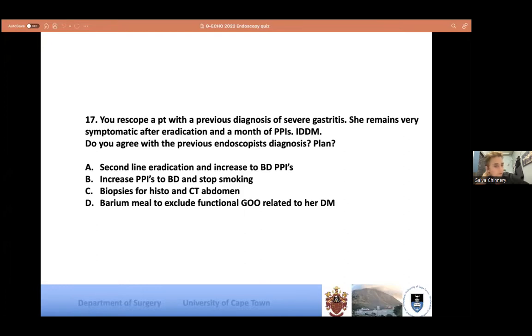Yes, thank you. So this is linitis plastica again. And I'm just putting another one in there just to show you how easily they are missed by ourselves. What the clue was here is that, yes, there was no obvious obstruction, but I'm sure you'll agree that tissue, that mucosa, was thick and just not distending nicely, and the entire stomach did look a bit smaller, more kidney shaped than usual, and didn't open up nicely at all. So this is linitis plastica as well.